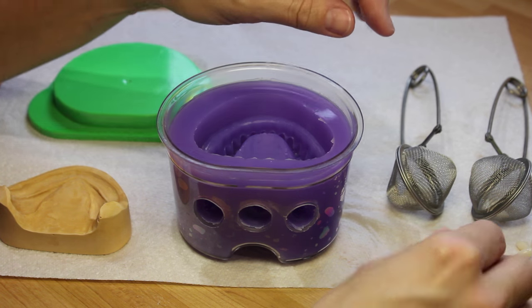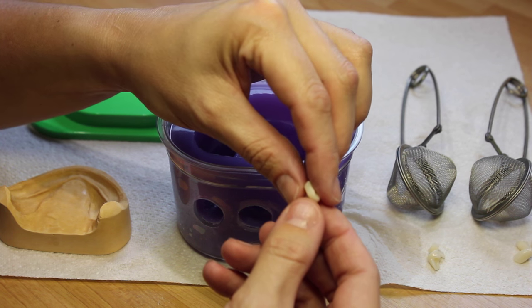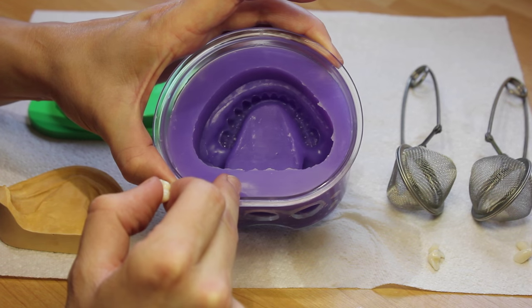This is a good time to roughen the teeth or add holes or channels to provide extra mechanical retention. Then you would need to carefully replace the teeth back in their location.